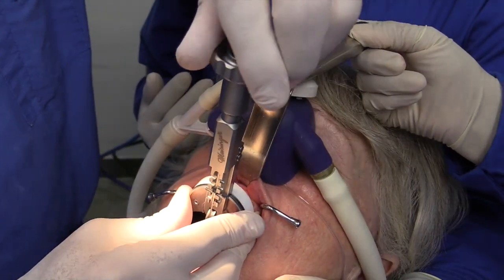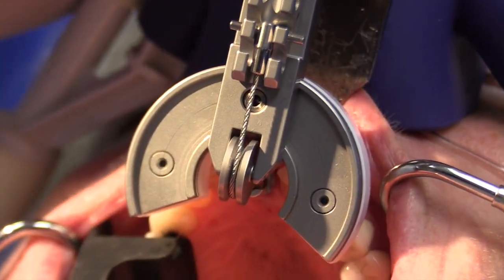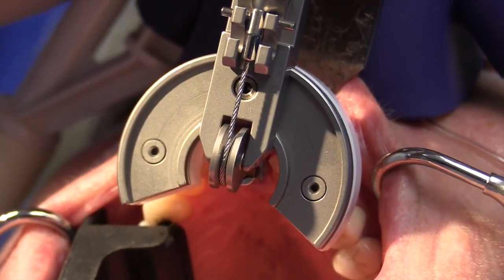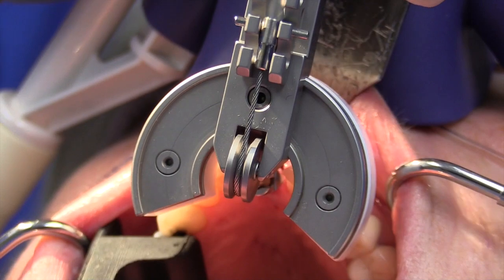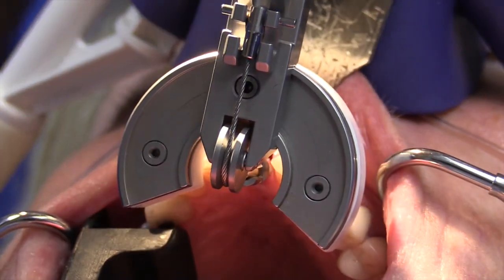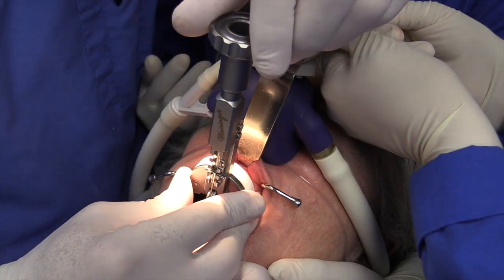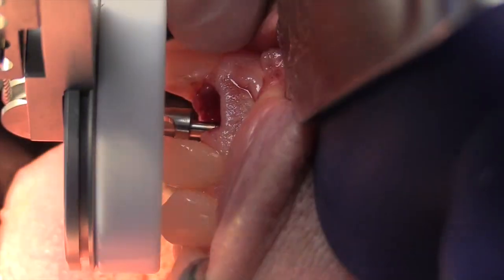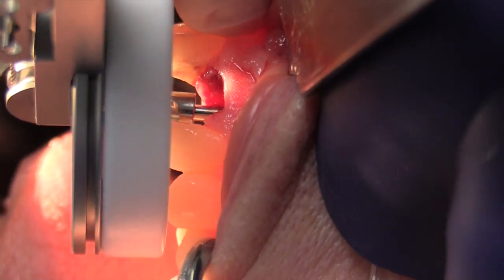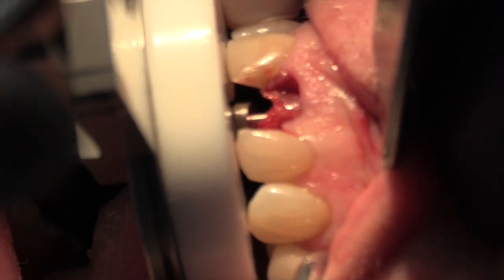At this time, the knob is rotated clockwise until some resistance is felt. Now we'll confirm again that the cable is relatively straight and that the handle platform is quite stable on the adjacent teeth. Next, we'll rotate the knob until resistance is felt, and then wait about 30 seconds, and then rotate it again for one to two turns. We're going to repeat this intermittent slow rotation and further tightening of the cable with pauses in between until the root is gradually mobilized.